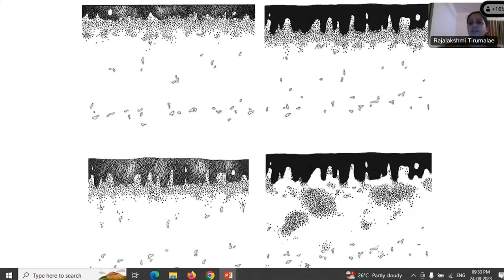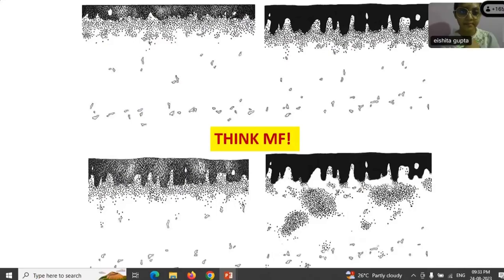So there are different epidermal patterns that you see. What are the patterns? If you see a lichenoid pattern, a spongiotic and lichenoid pattern, a psoriasiform and lichenoid pattern, or a spongiotic, psoriasiform and lichenoid pattern, and a psoriasiform nodular pattern with a dense dermal infiltrate of lymphocytes, think of MF. Think of it, but don't confirm it unless the clinician is also on board with the diagnosis.